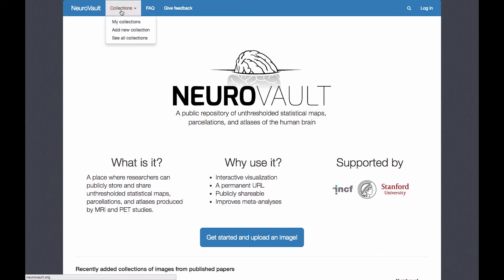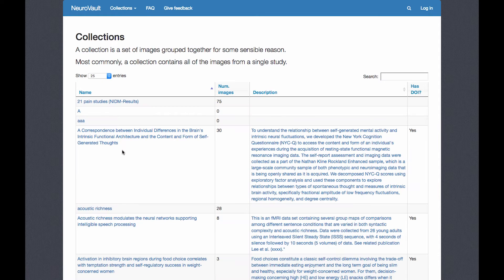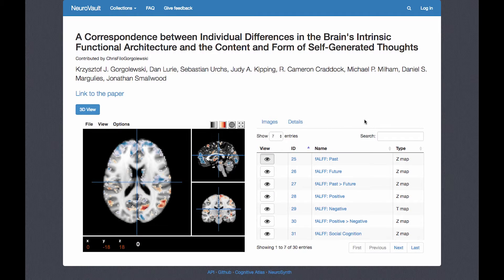To see what they have, click on Collections, See All Collections, and then click on whatever study interests you. This will give you a list of different group-level maps or different contrasts. In this case, let's say past greater than future.